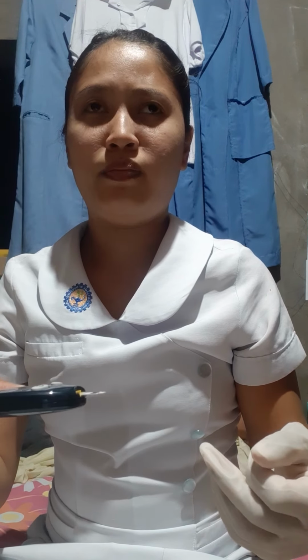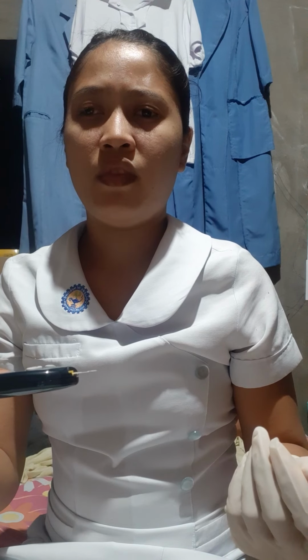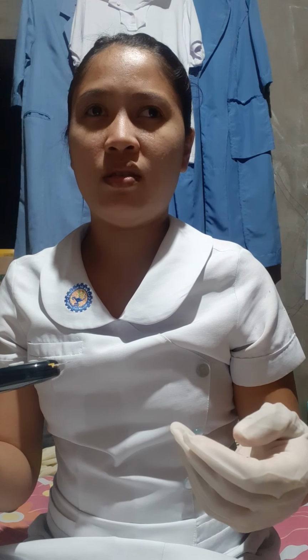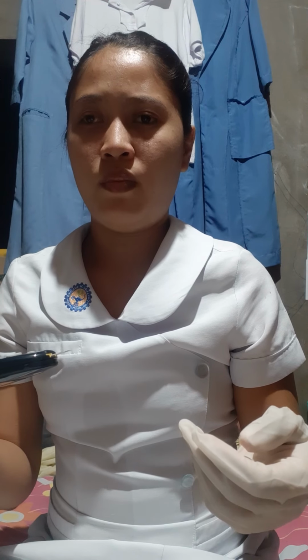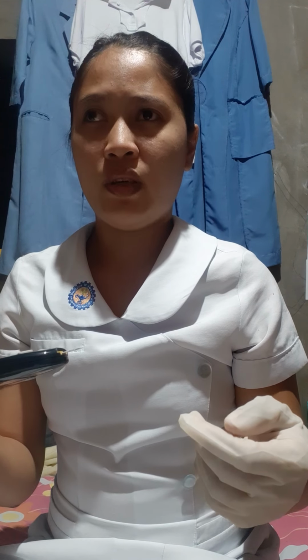It is important to follow it so that we can have an accurate result afterwards and avoid any mistakes, because the blood must remain in contact with the strip as prescribed by the doctor, or according to the manufacturer's instruction, so that we can get the accurate result.